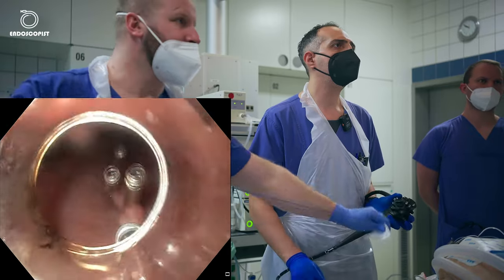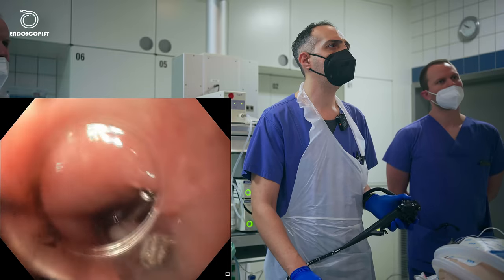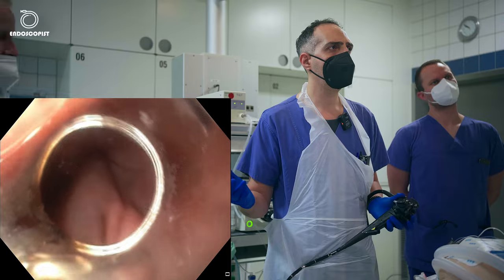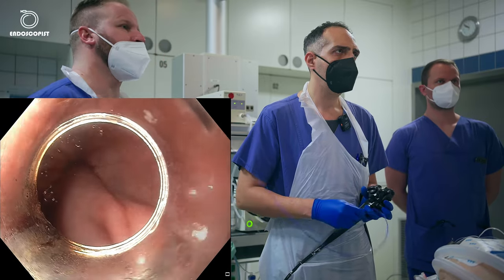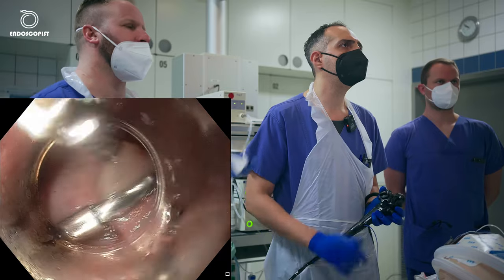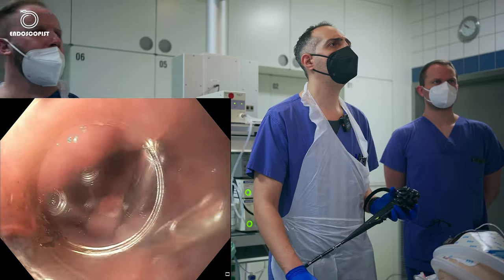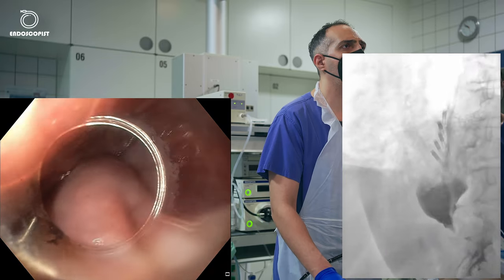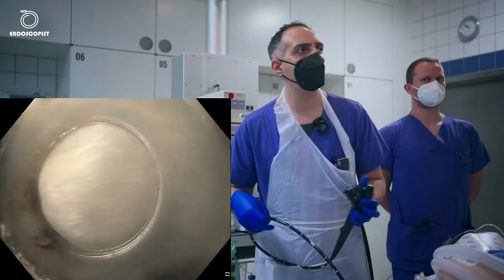So this extra clip is only for security, in case one clip comes off. Perfect. So the examination is finished. We'll do now a barium swallow to see that everything is fine, and that's it. Thank you.